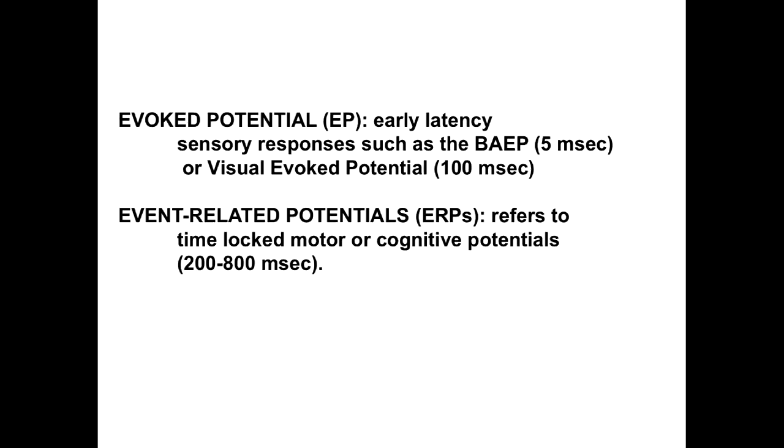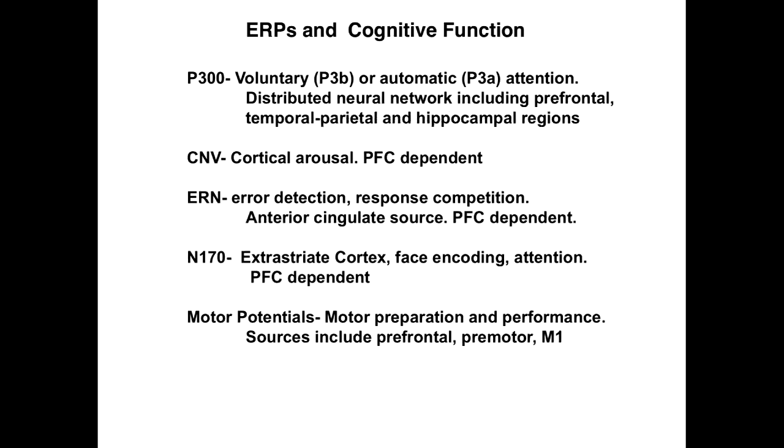Now I say to you, press a button whenever there's a missing stimulus. So there's no sensory response at all. Beep, beep, beep, beep, beep, and you detect a missing stimulus, you still get the detection potential. So you're completely dissociated from any sensory input, period. There was none. So this is a beautiful separation between externally driven and internally generated. And you'll see later, this is very powerfully used for spelling programs in patients with very bad communication disorders.